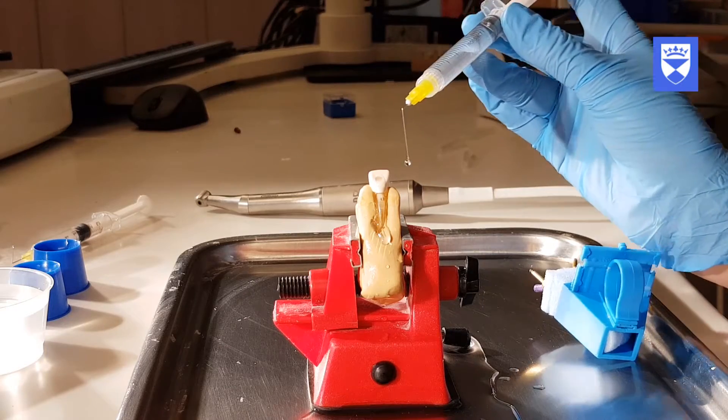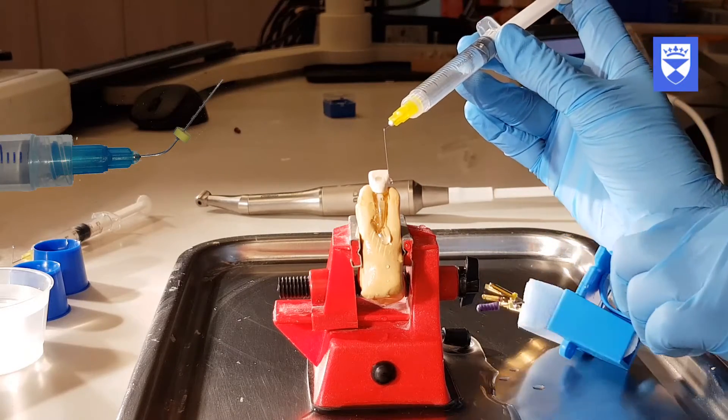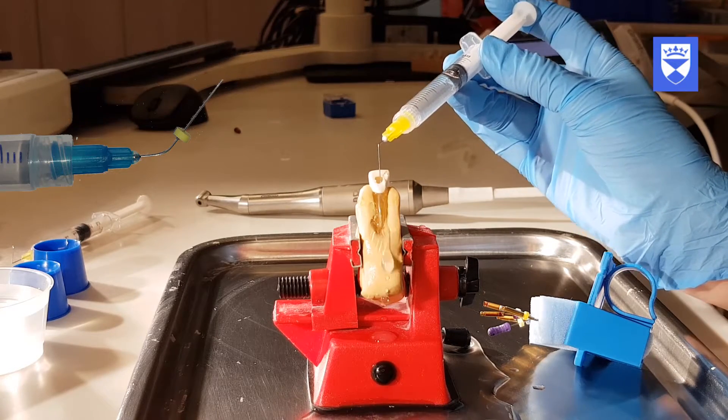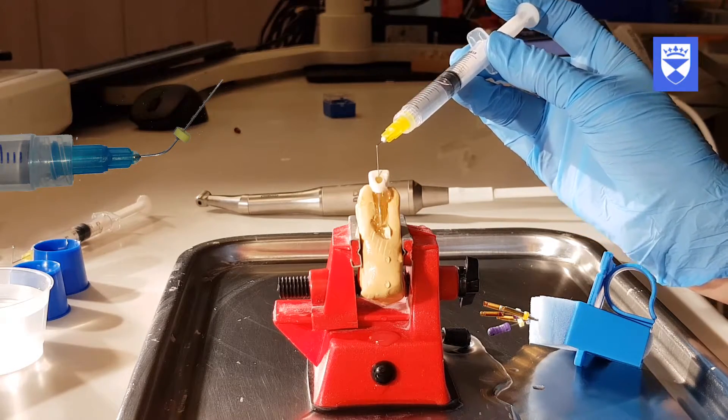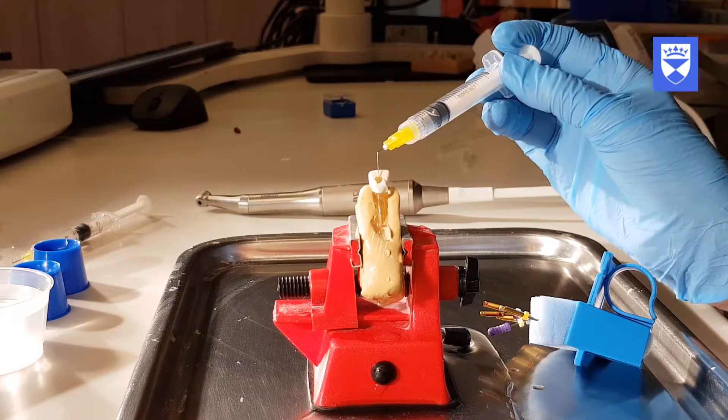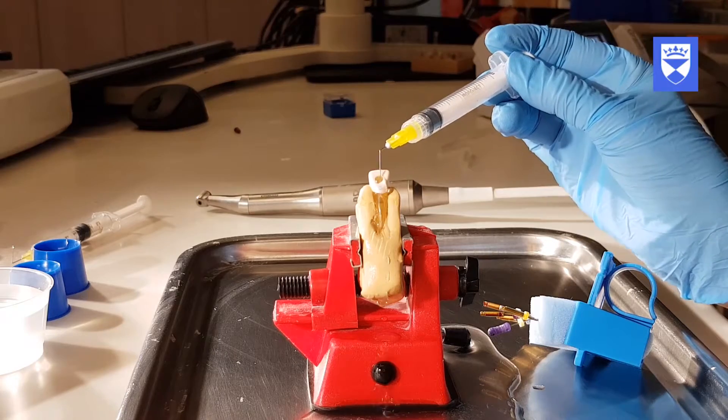The canal should be irrigated with 3ml of sodium hypochlorite, recapitulated with a size 10 flexofile and irrigated again before using the next file. Remember to keep the tip moving when irrigating to prevent it from locking in place.